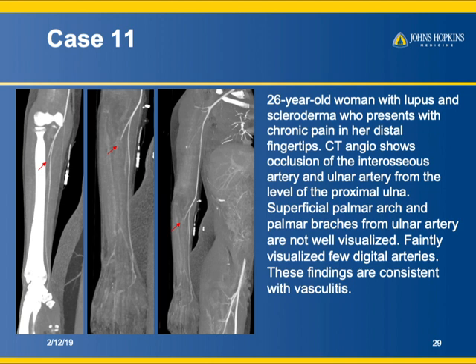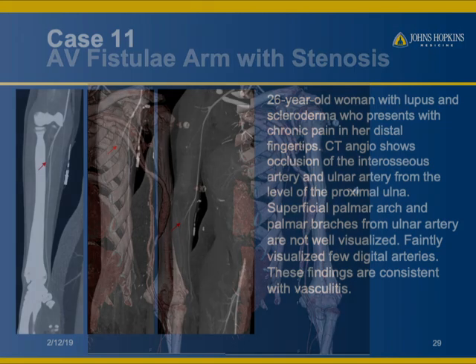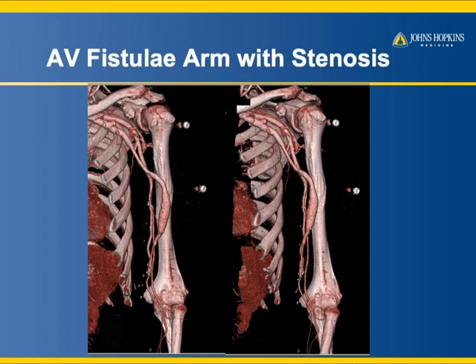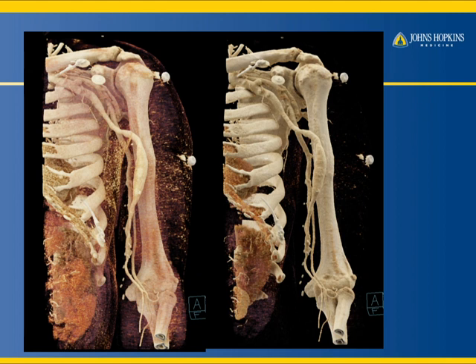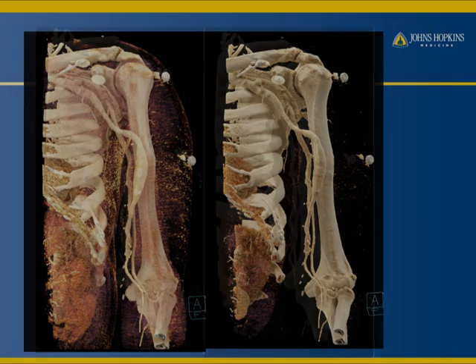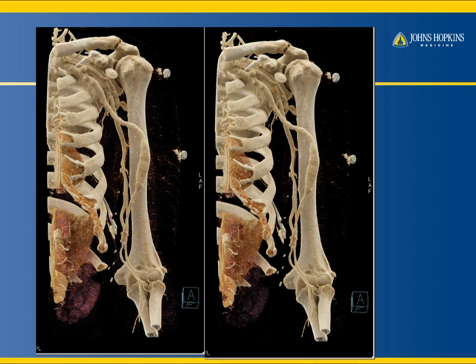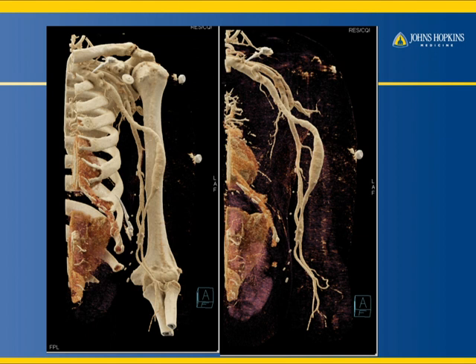Think about complex patients with symptoms. You can see the beauty of bone removal from this dual-energy data set. Another example: a patient with a dialysis fistula now has stenosis. Several volume renderings show the narrowing nicely, and cinematic rendering provides a more realistic, better display of the stenosis.